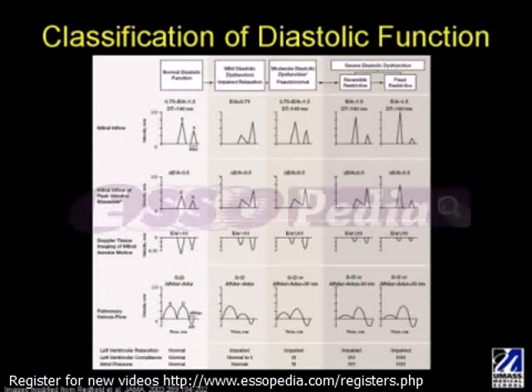Let's now shift gears to the classification of diastolic dysfunction. This information was obtained and modified from Redfield et al., from JAMA 2003, which dichotomizes both normal and abnormal diastolic function. This schematic includes the mitral E to A ratio, deceleration time, Valsalva maneuver, DTI, and pulmonary vein Doppler.